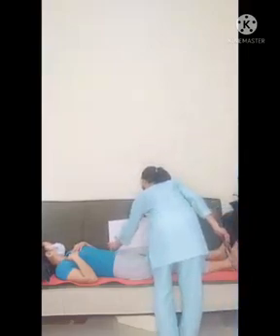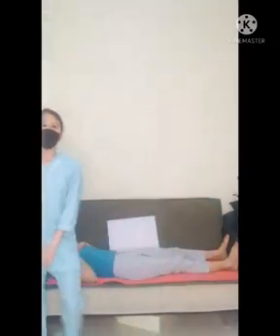So, our image receptor, nakaganyan po siya sa ating pasyente. So, the center of the IR is at the mid-sagittal plane at the level of the iliac crest.